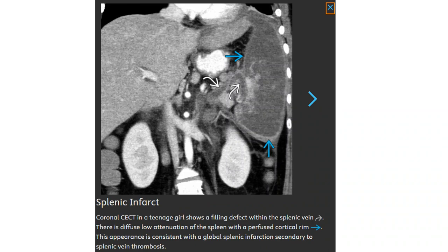Contrast-enhanced CT in a teenage girl showing filling defect within the splenic vein. There is diffuse low attenuation of the spleen with a perfused cortical rim, consistent with a global splenic infarct secondary to splenic vein thrombosis.